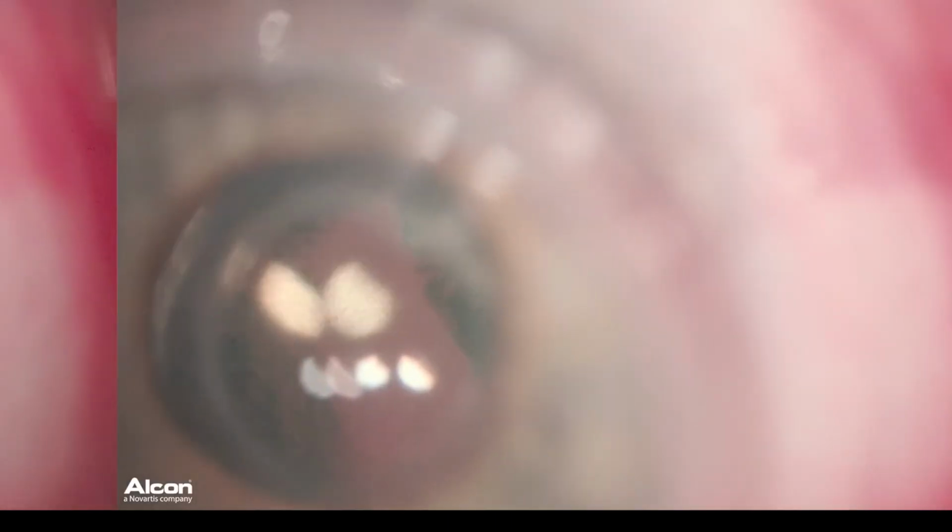And so we're timing our grabs to coincide with the patient's movement. Now the beauty of this system is, as you'll notice, the eye never goes out of focus. The retina never goes out of focus. And this is absolutely critical when you're peeling membranes on a patient who has this much movement.